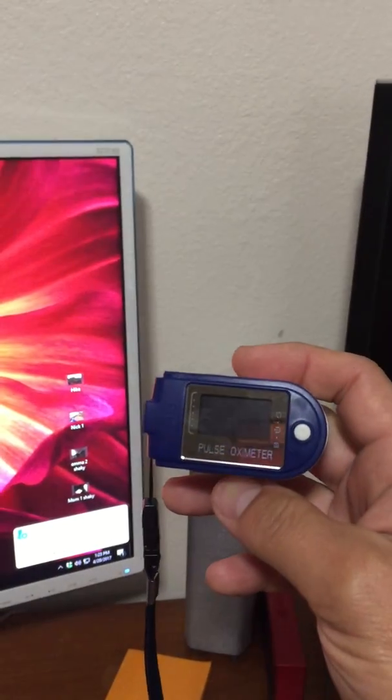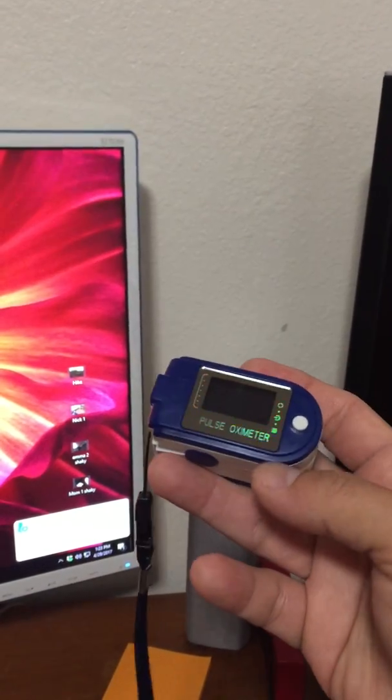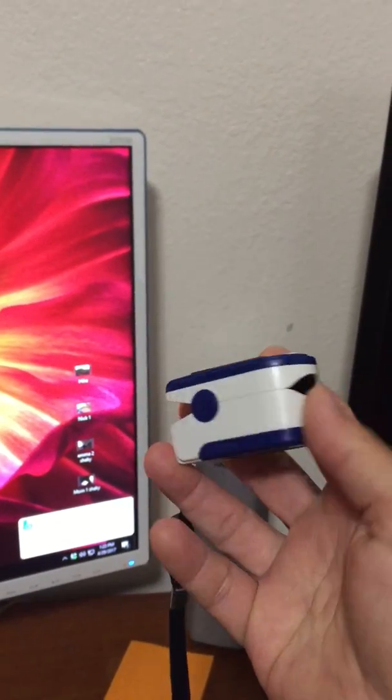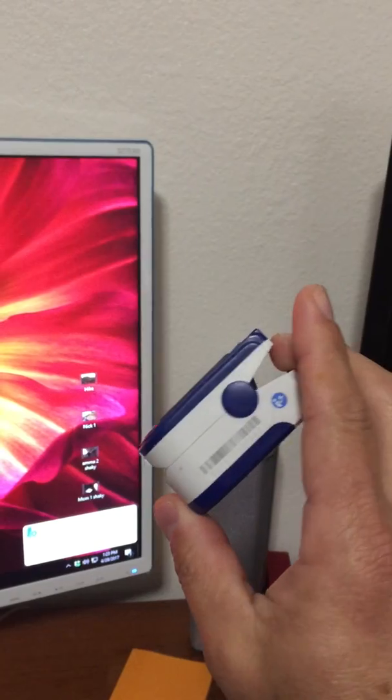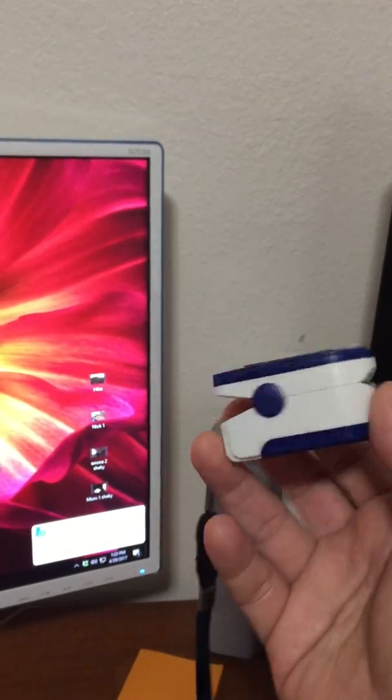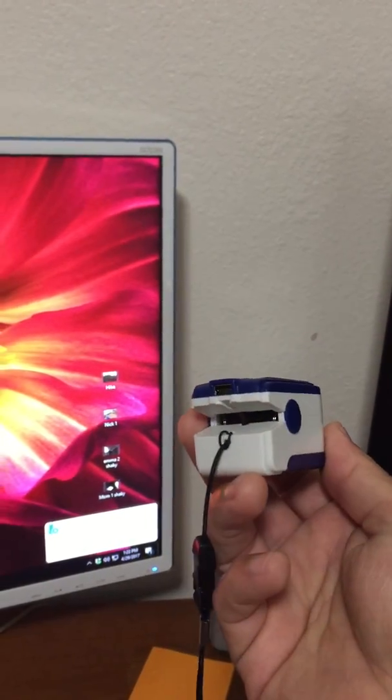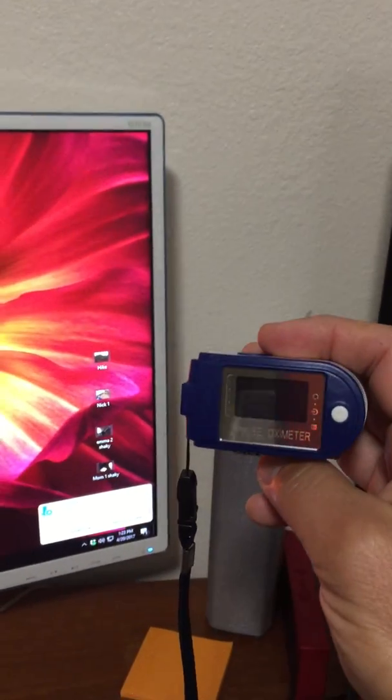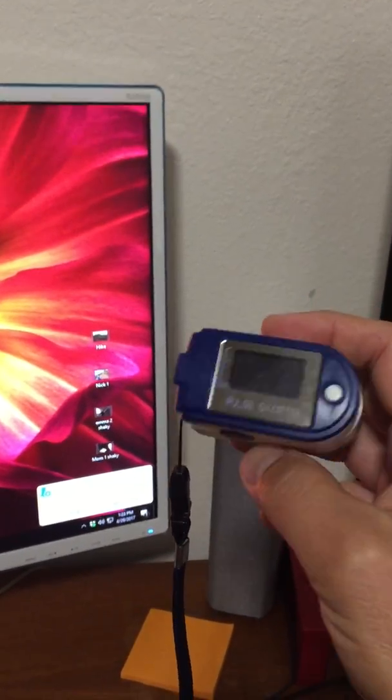This video shows how to download data from the pulse oximeter. It's a very quirky program, so I just wanted to video it for people's use.